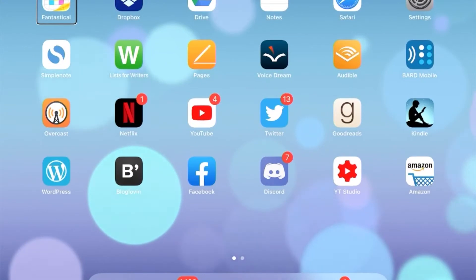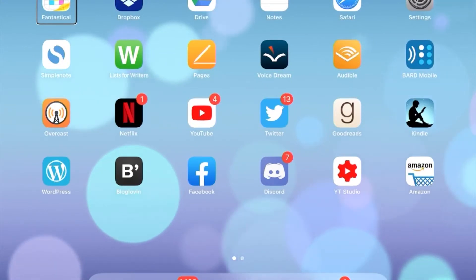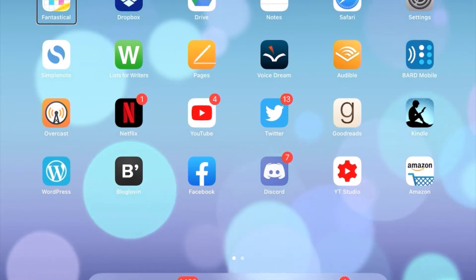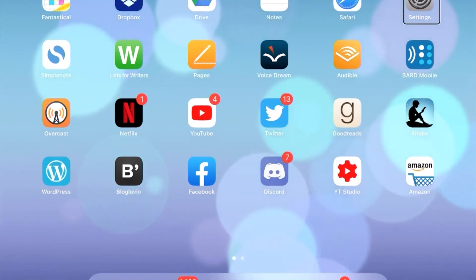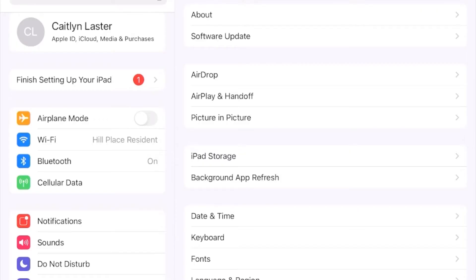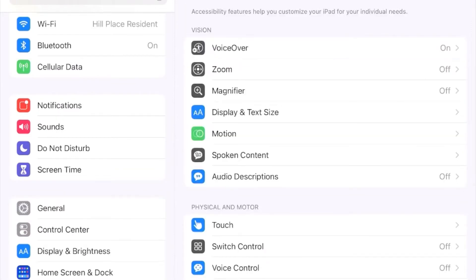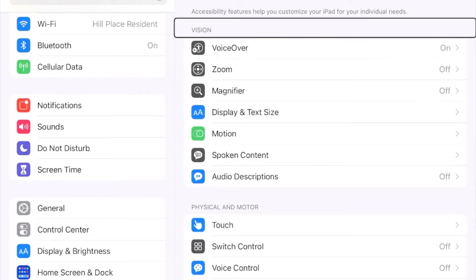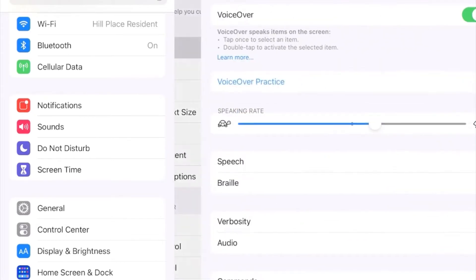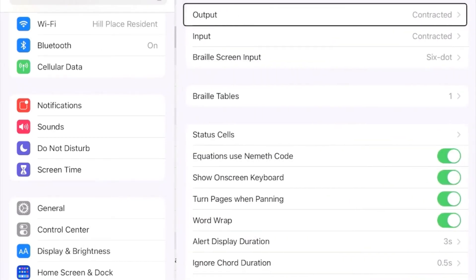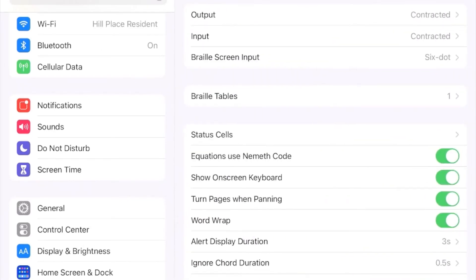You are now looking at the home screen of my iPad, which is running iOS 14. To connect your Braille display, go into Settings, then Accessibility, then VoiceOver, and then Braille. This is the navigation path: Settings > Accessibility > VoiceOver > Braille.